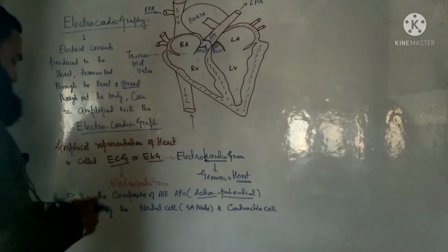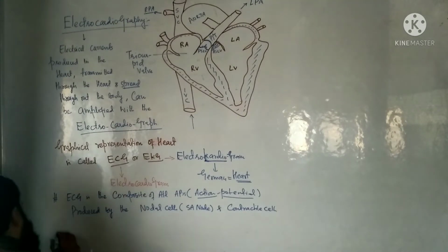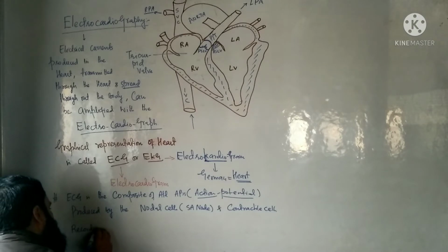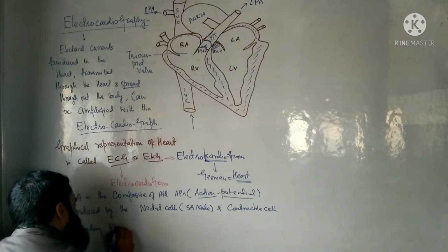Then another point, we use recording electrodes.